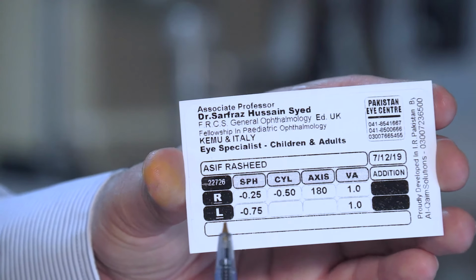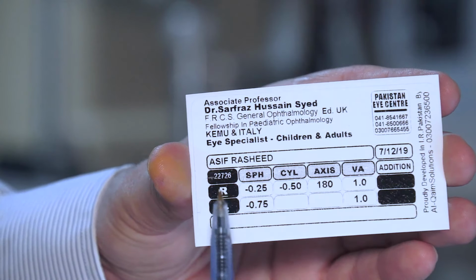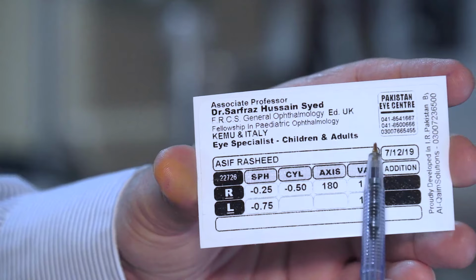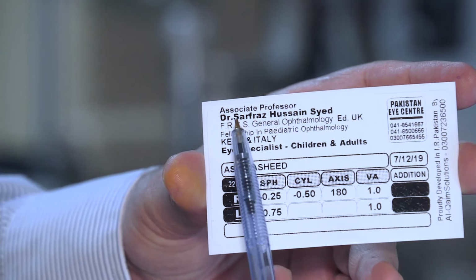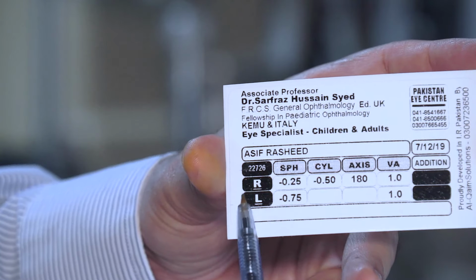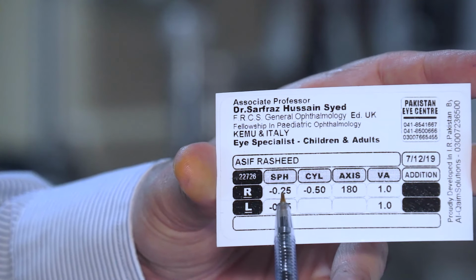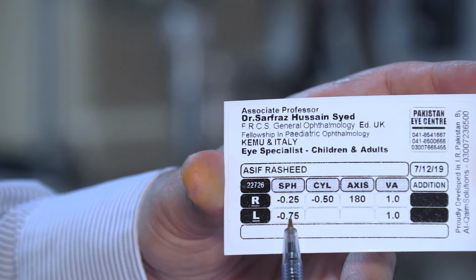Now this is a standard prescription for spectacles in which the patient's name is written here. There is a date on which this was tested, and the doctor who tested has his name over there. Now R stands for the right eye, L stands for the left eye, and this is the spherical. Minus 0.25 is the spherical lens in the right and in the left it is minus 0.75.